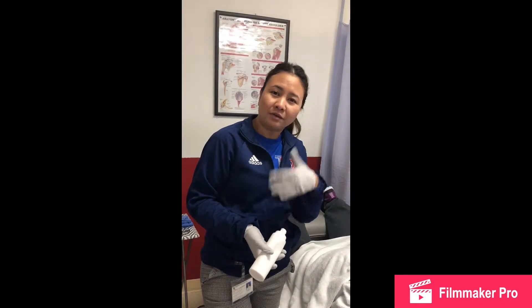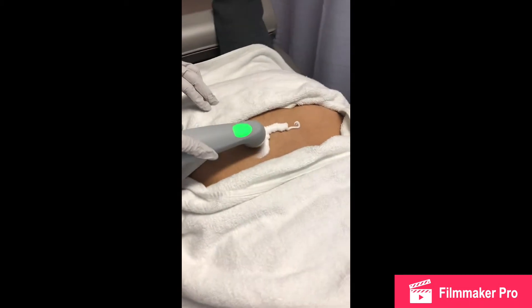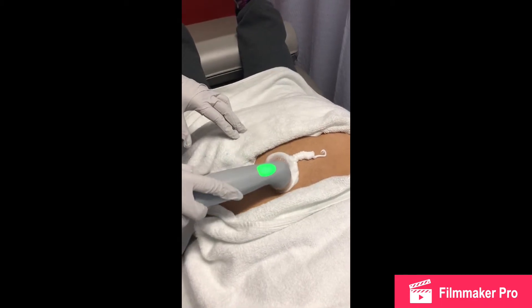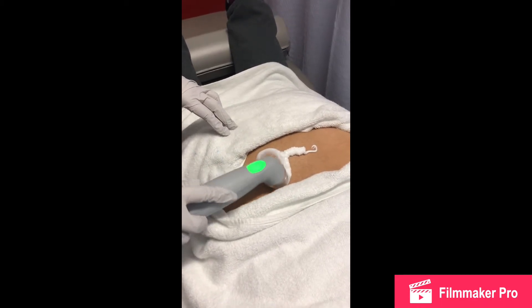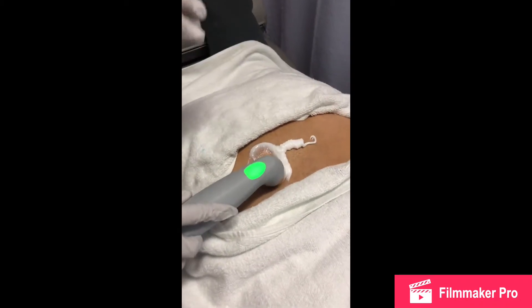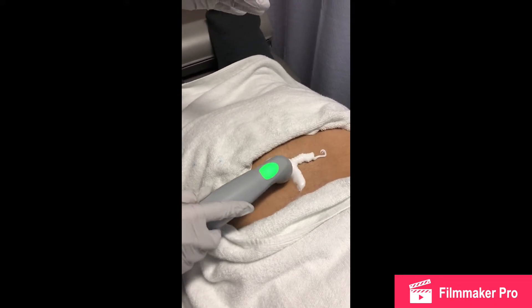Mark, behind the camera, our PT assistant, is going to set the ultrasound for me and we'll get back to you. Okay, so we're back. Right now we're going to be doing ultrasound on the paraspinal area, focusing on the lower lumbar area — L3 to L4, L5 to S1.